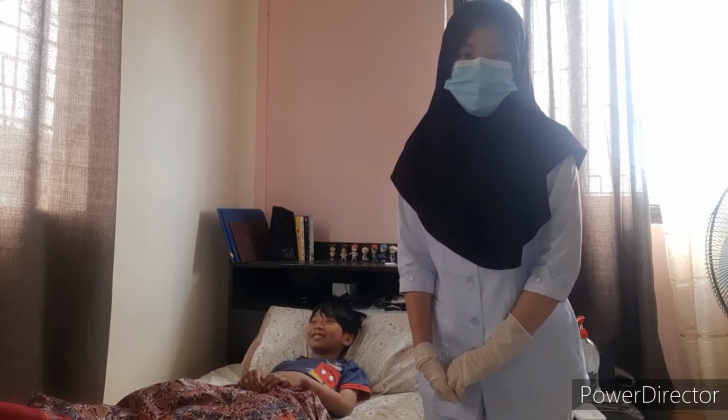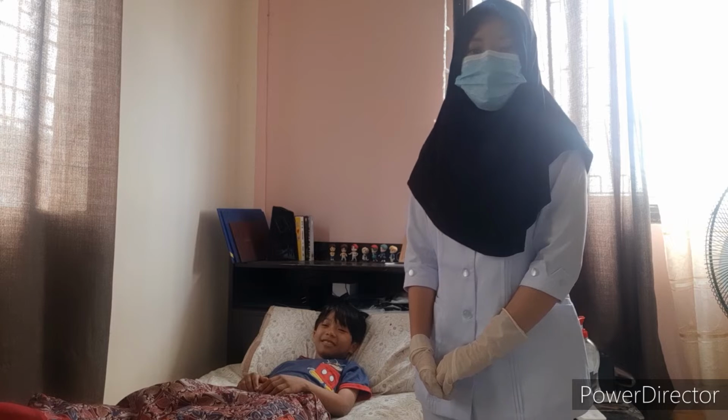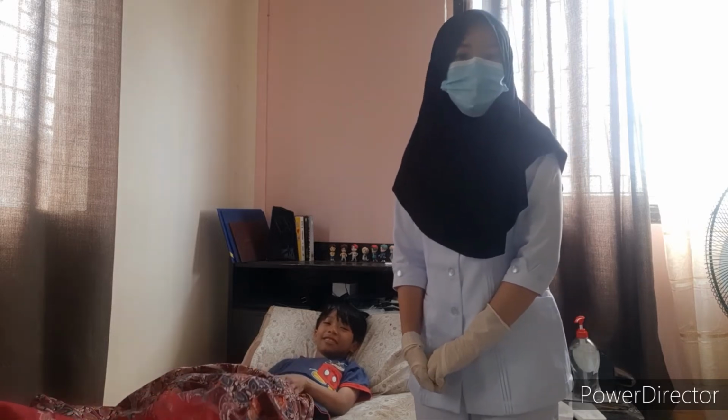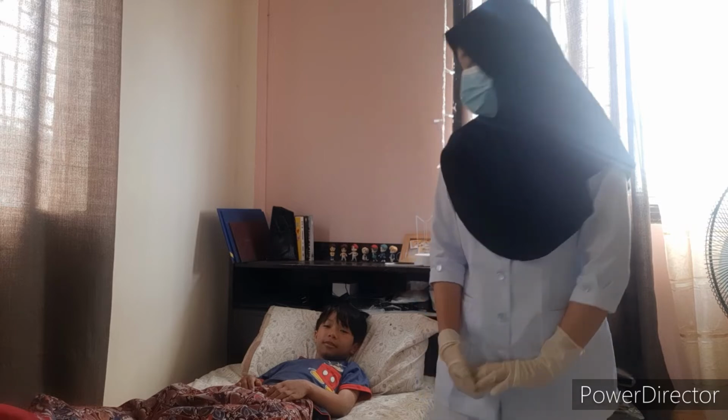Provide the privacy and place the patient in a side-lying position. So this is to maintain the client's privacy and promote the comfort. So expose the anal area for the correct thermometer placement.